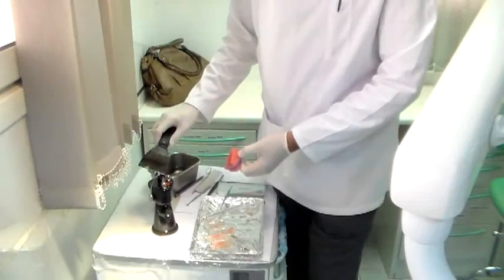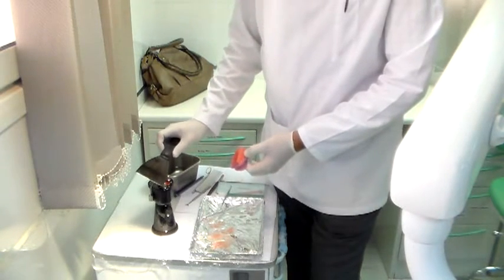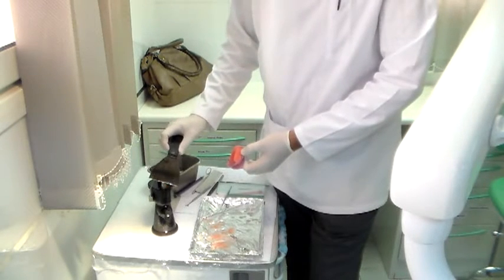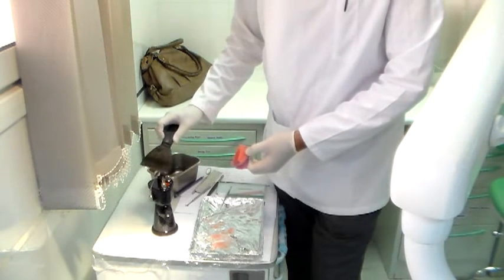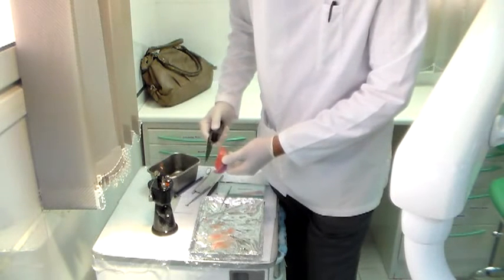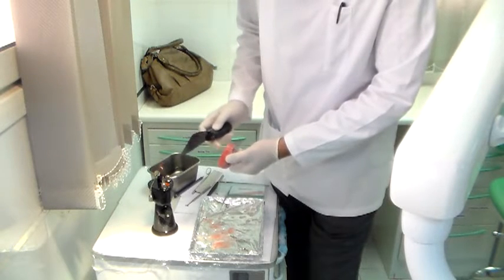You start heating up the entire plate. As always, make sure that you heat the entire plate. It's very important that you heat the entire plate, otherwise you will not be able to make a proper reduction in one plane. You want to touch this and just stop till here, because you don't know if this side needs to be reduced or not.